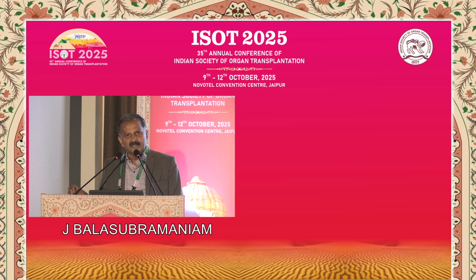B-mode imaging, Doppler, elastography, and so on. But I still feel that they are all not adequate. Although very good illustrative cases were presented where they picked up early and intervened, there will be situations where they are insensitive and you may not be able to differentiate between different types of graft dysfunction and even between normal and abnormal in some cases. So we are ever looking for newer techniques which you can do repeatedly without any problem for the patient, without any issue of toxicity.